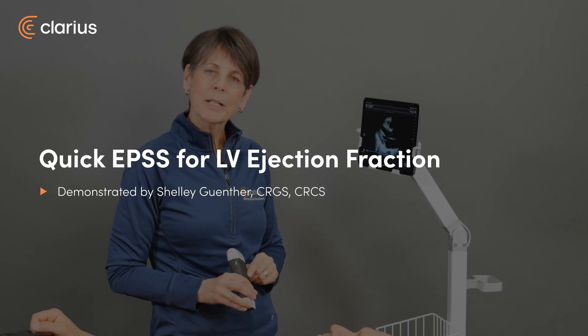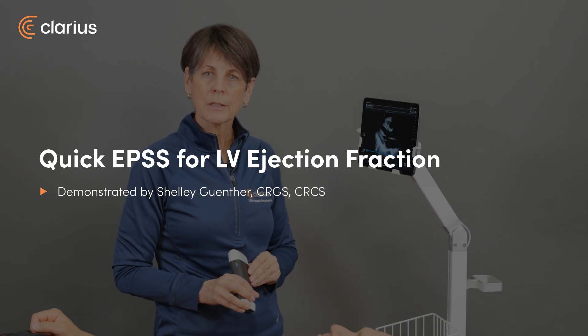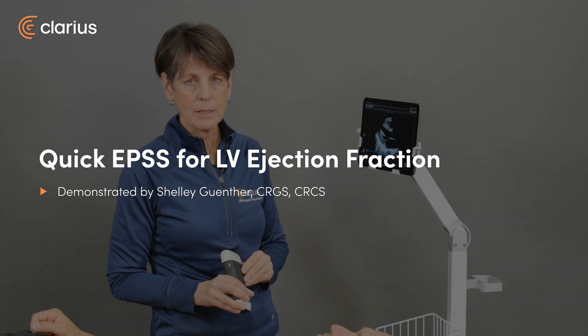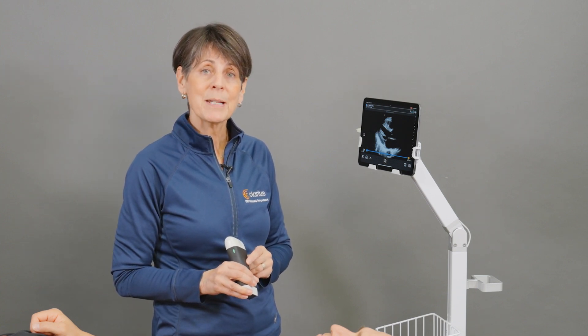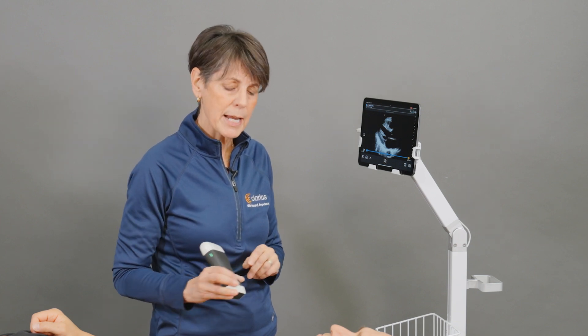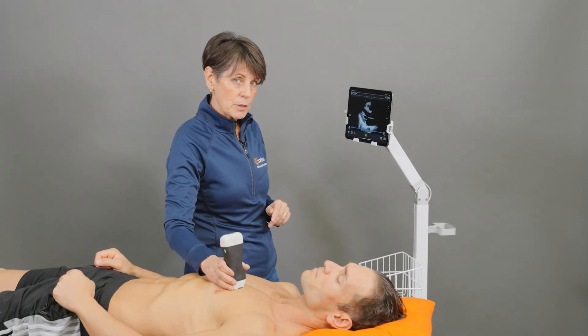Hi, my name is Shelley. When you want to do a quick left ventricular ejection fraction estimation, sometimes the eyeball method isn't that convincing, or sometimes you just need to quantify that number. The way you can do that is to perform an EPSS measurement, or E-point septal separation. We do that in M-mode and from the parasternal long axis view.